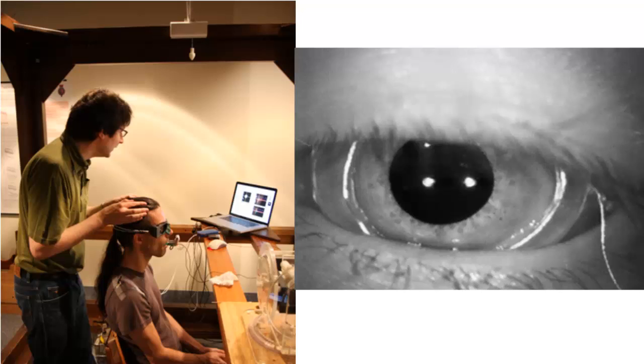The University of Sydney group made this discovery using the scleral search coil method. This is a highly accurate method for measuring fast three-dimensional eye movements. Unfortunately, the search coil method is not suitable for routine clinical testing because it often involves anesthetizing the cornea to place contact lenses that contain small coils with wires attached to them.